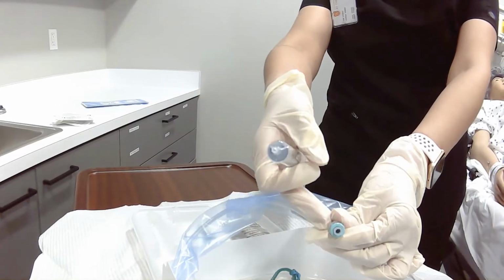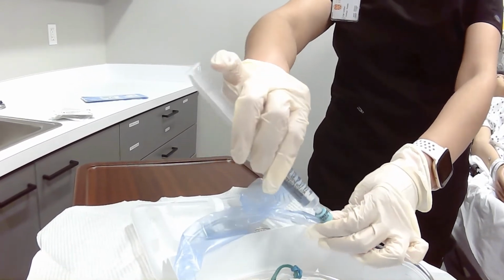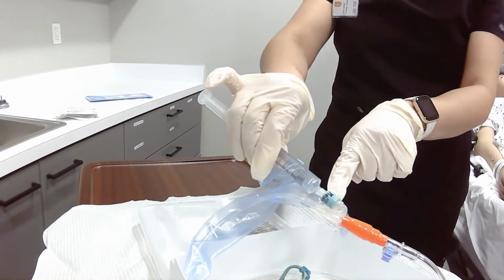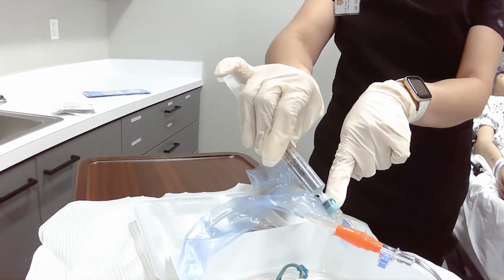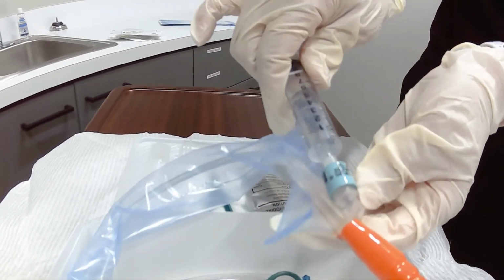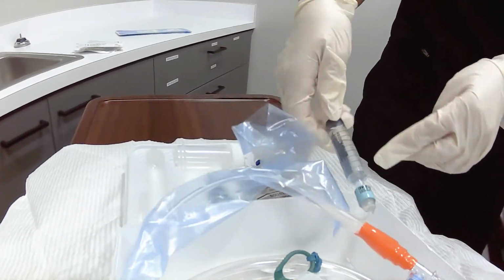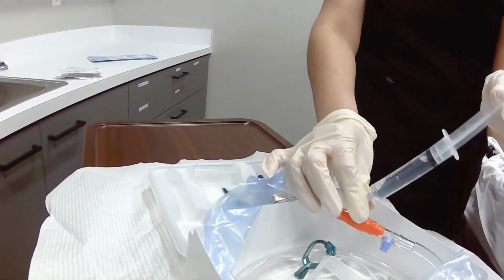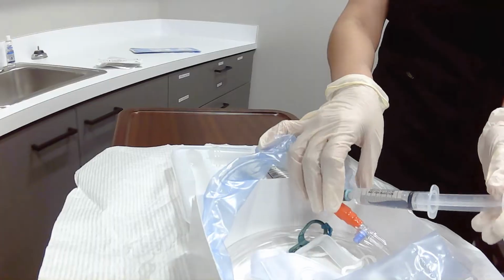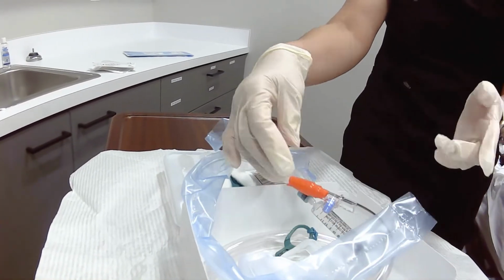It's going to go into this port. So this port is going to be different colors. It's going to give you the size. So this one has the 14 gauge on there, or 14 French, I'm sorry, 14 French. And it's strictly for the sterile water to fill the catheter or the balloon.